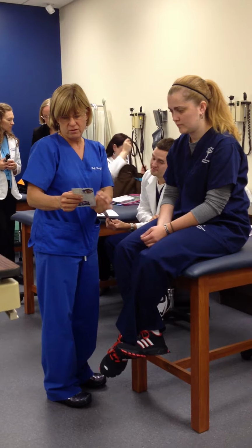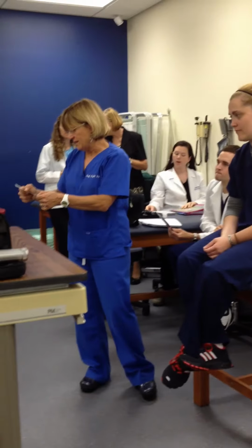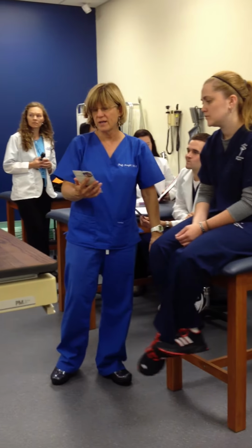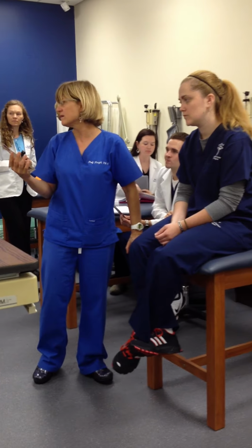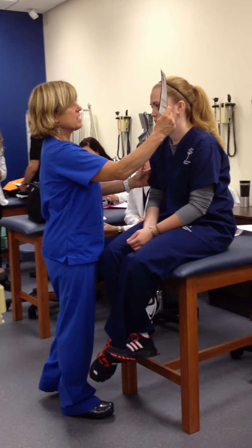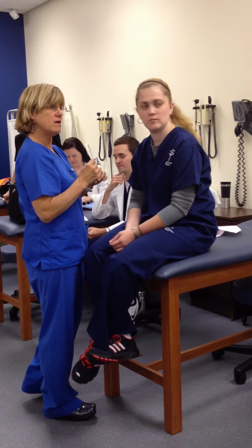And you're good, 20/20. How many do you have to get right to count that line? You need to get them all right. So one wrong? Yeah, one wrong gets you into the line before. Okay? And then our pupil gauge is on there also, and we just kind of hold it up like this and see which one.